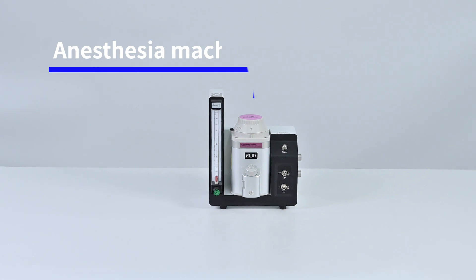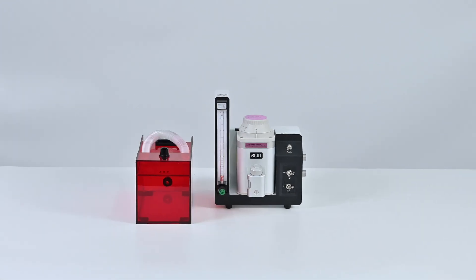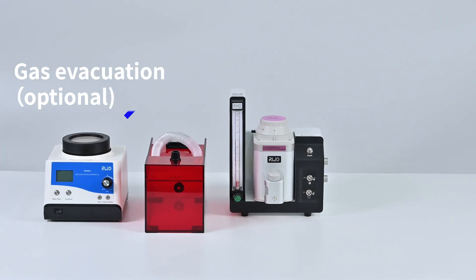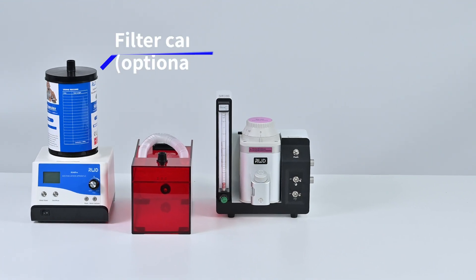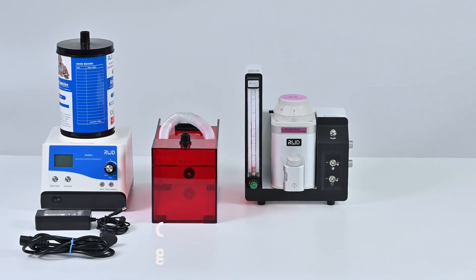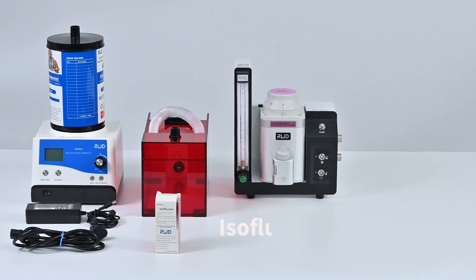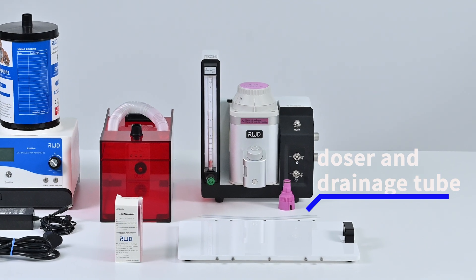Components included: anesthesia machine, induction chamber and bellow tube, gas evacuation apparatus, filter canister, charger of gas evacuation apparatus, and isoflurane.